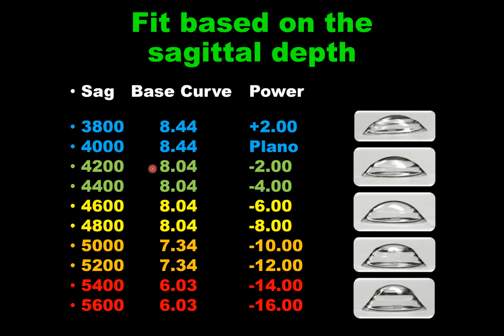Now this is different from most scleral lenses where they need to have different base curves to have different heights. Using the spline technology, the smart lens is able to create different heights of lens using the outer zones of the lens. So base curve is not used as a tool to create a higher or lower depth.